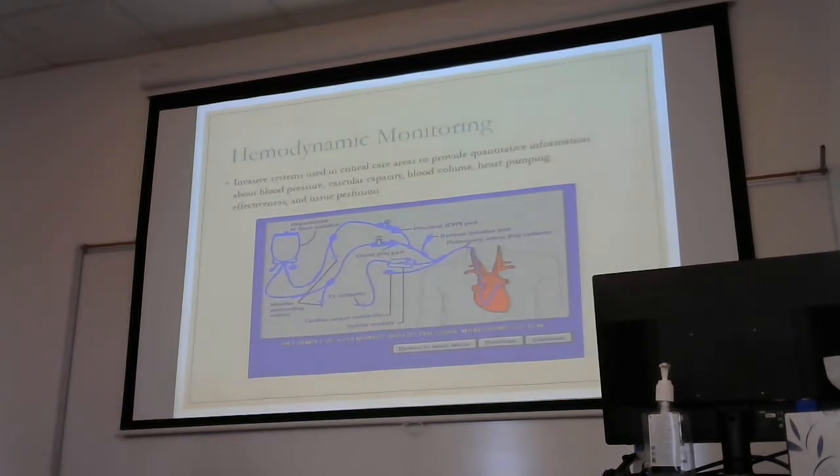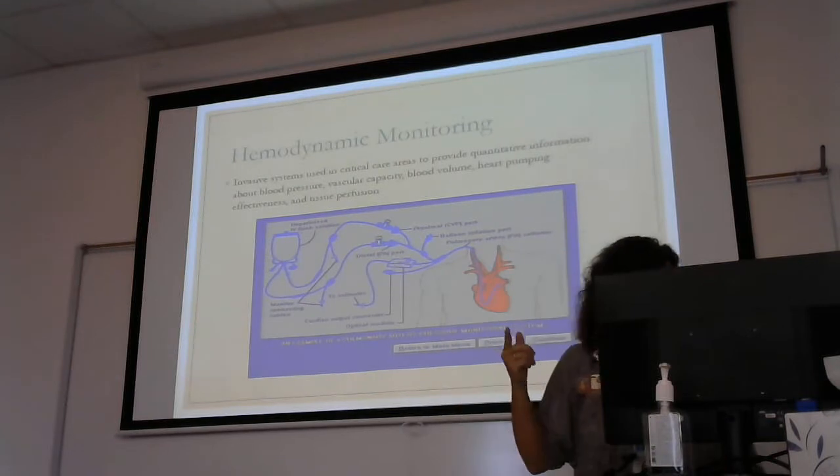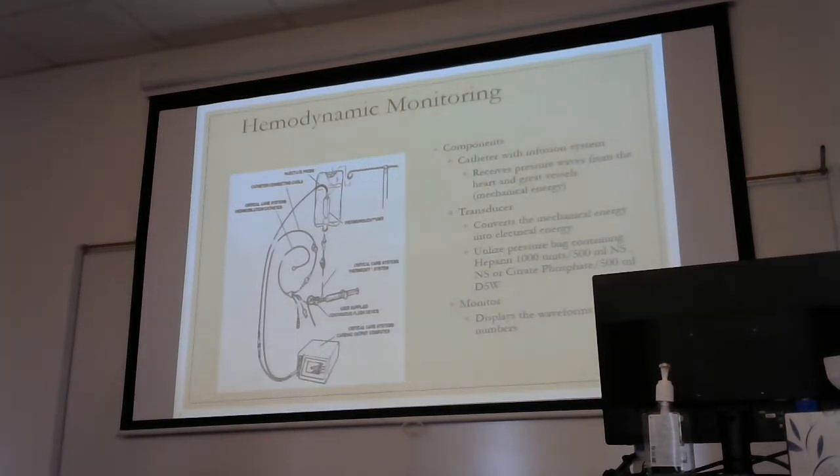So we have this catheter that's inserted and goes into the pulmonary artery. So is this an invasive procedure, guys? It is. So knowing it's invasive, what are you already worried about? What are you thinking in the back of your brain? Infection. What else? It's in the vascular space. What else are we worried about? Bleeding, hematoma. Okay, we get that, okay? So see, that's what I'm saying. You don't need to memorize that. You already know that. But I want to show you how we get these numbers. Don't worry about this either. Just want to get you to understand some things.